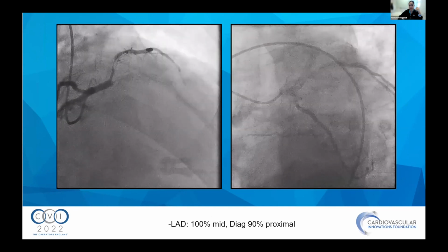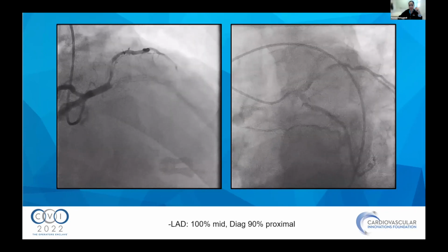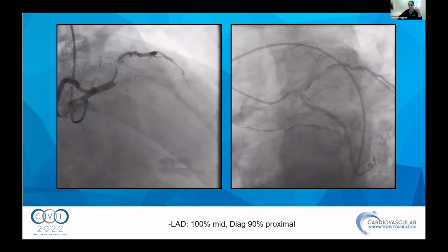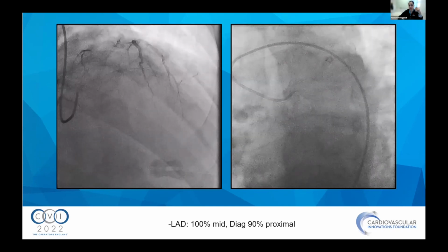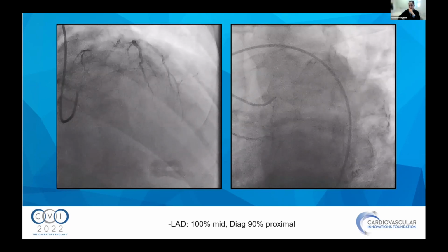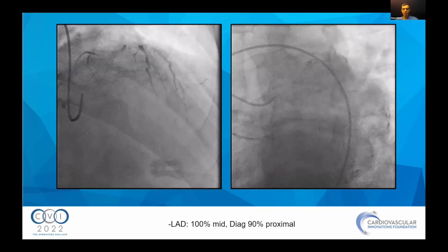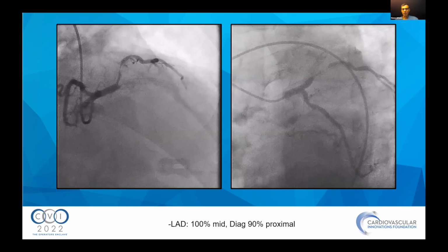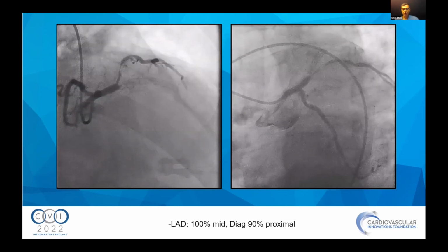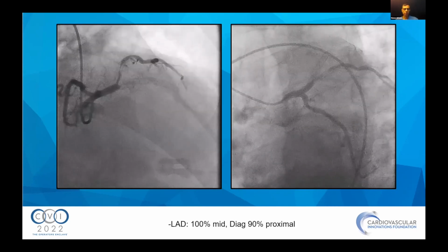It's a young patient, has this stenosis in the LAD and diag stents, and then also the RCA disease. So anybody, what would you do at this point? I guess he's not a good candidate for surgery, right? I mean, he looks 37, but a lot of comorbidities, dialysis. I think this is a complex PCI, but I would probably think PCI might be the better way to go. I don't know, Haider or Arnold, any other thoughts?